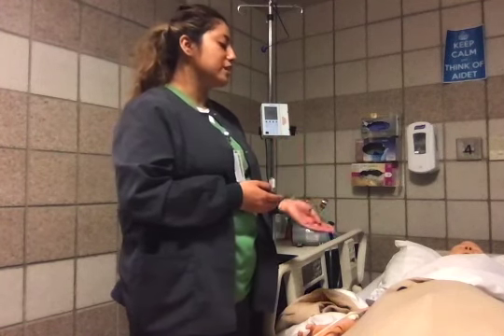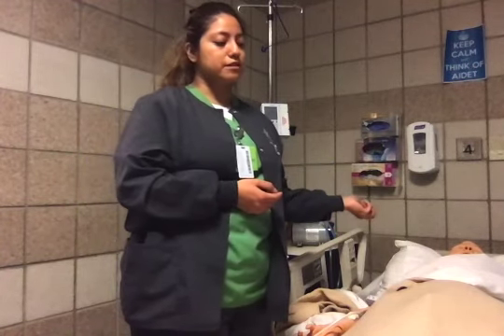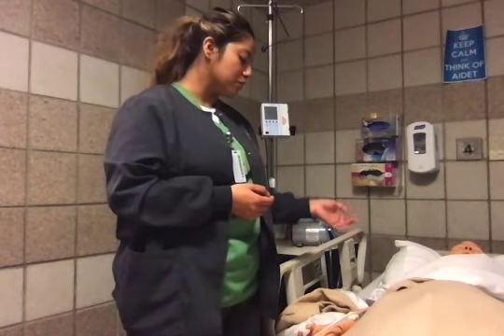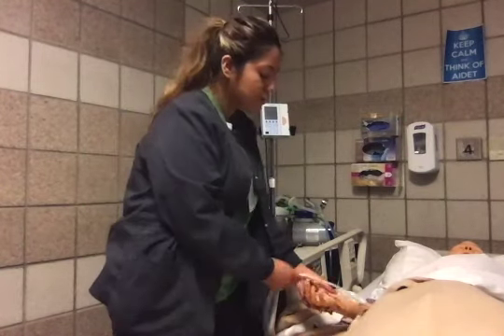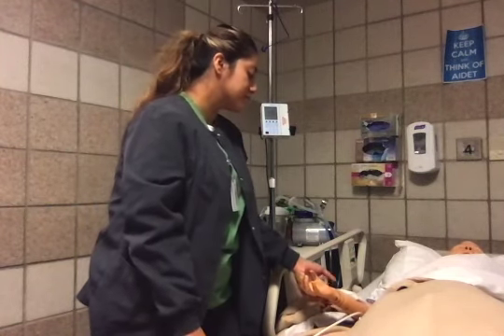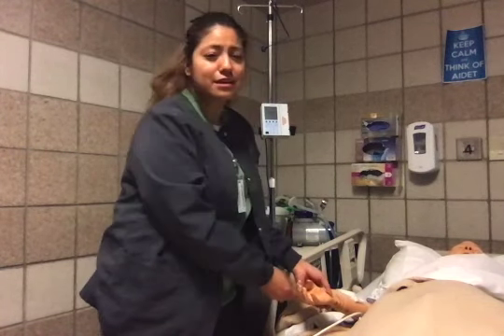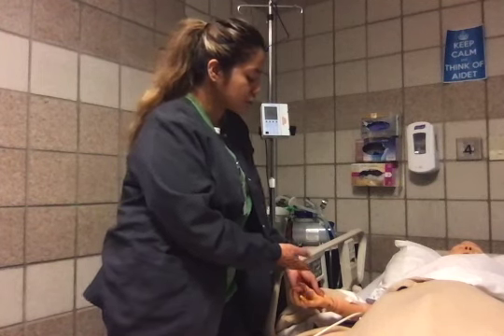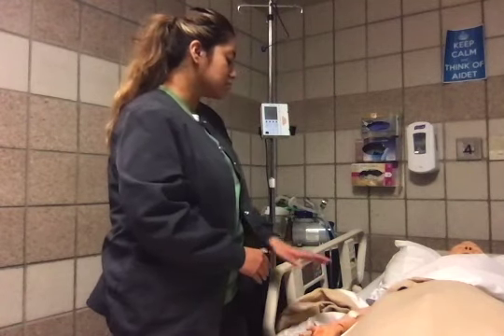For this medication, my assessments are going to be to listen to his lungs, his heart, and bowel sounds. Actually, before I do that, I will check my patient's wristband and confirm his identity using two identifiers. Can you please tell me your name and date of birth? Okay. Also, while I'm doing this, I'm going to be assessing his IV. I'm going to be looking for redness, infiltration. I'm going to check if it's swollen or if it feels warm or cool. Okay, so it looks fine to me.